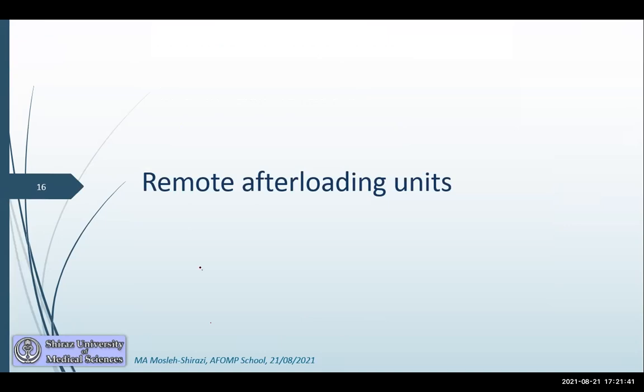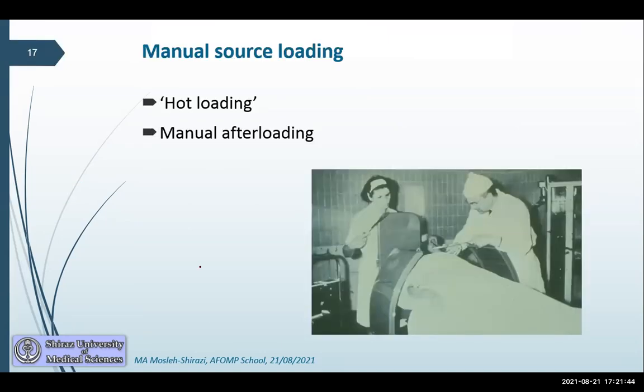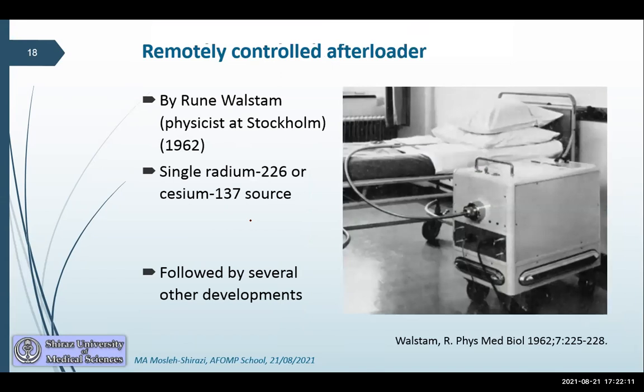Remote afterloading units, some history on that. Manual source loading, it was to begin with. Hot loading even, straight without even a needle going into the body. And then manual afterloading, i.e. first inserting the catheter or needle or applicator, and then by hand putting something like iridium wire, for example. Still lots of problems with radiation protection, so came remotely controlled afterloaders, where the operator would be outside the room, like for example in the setting of a linear accelerator.